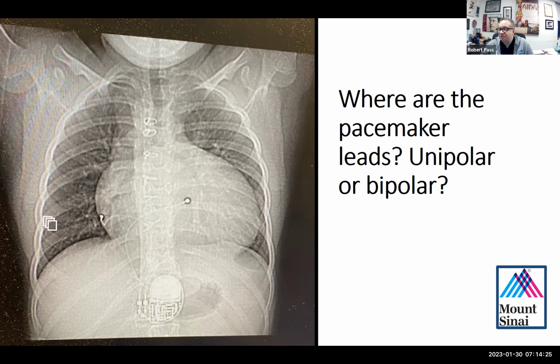I think this patient had congenital heart surgery, as we see from the sternal wires, and this is post-operative complete heart block. This was neonatal surgery, although the patient at the time of this x-ray is quite a bit older. He's no longer a neonate.